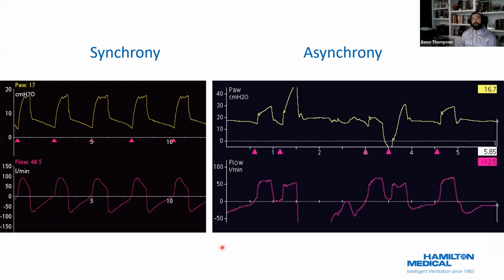And when you apply that to a ventilator, as respiratory therapists, it's our job to figure out what the patient wants, right? Because every patient has a set neural respiratory pattern that they want to follow. And I don't know about y'all, but I'm not a mind reader. So the only way I can discern what the patient wants is using the ventilator waveforms.